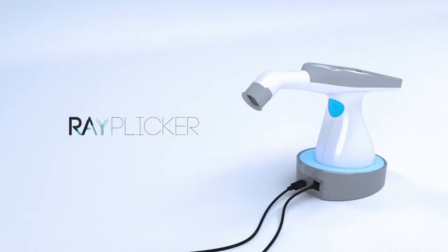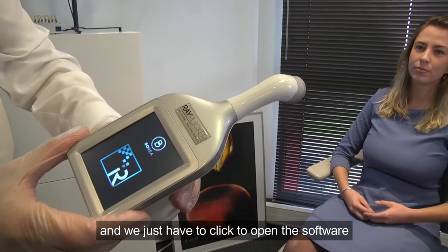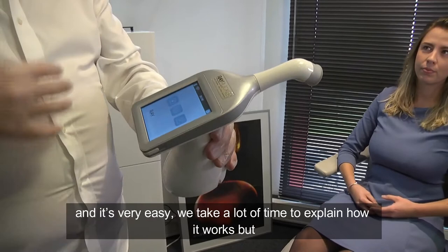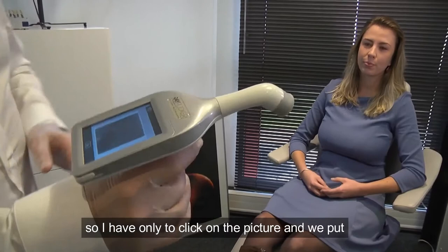Let's start at the forest. We start with the replica and just have to click to open the software. It's very easy — we took a lot of time to explain how it works, but now it's so easy to use. All the technology is inside, that's why it's amazing.